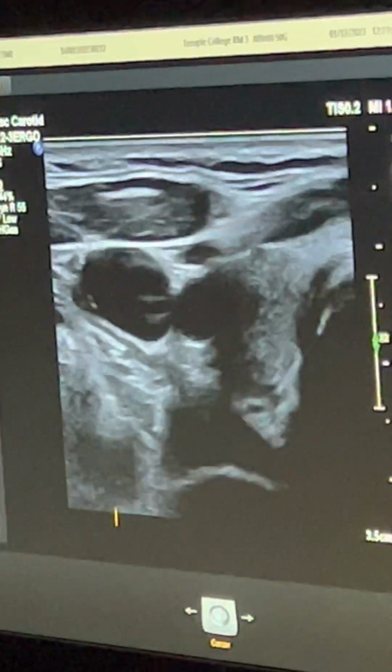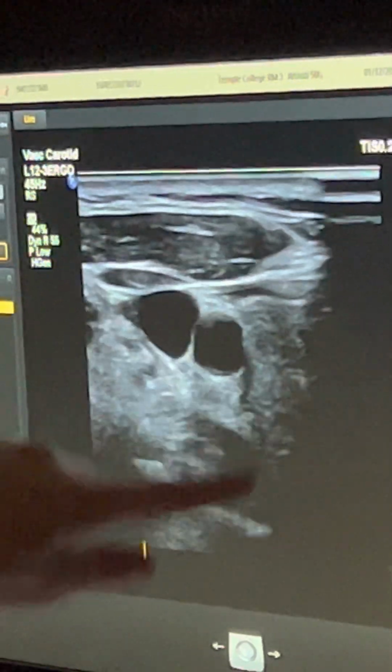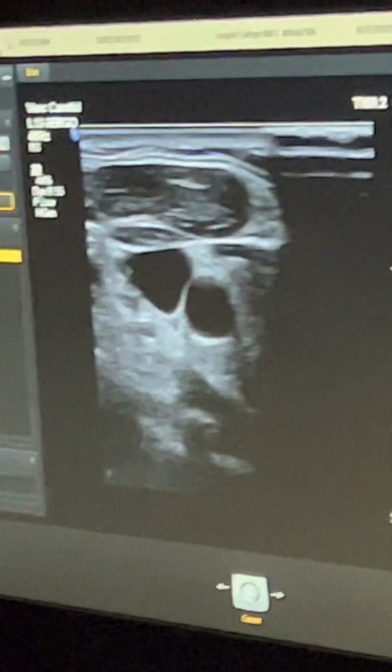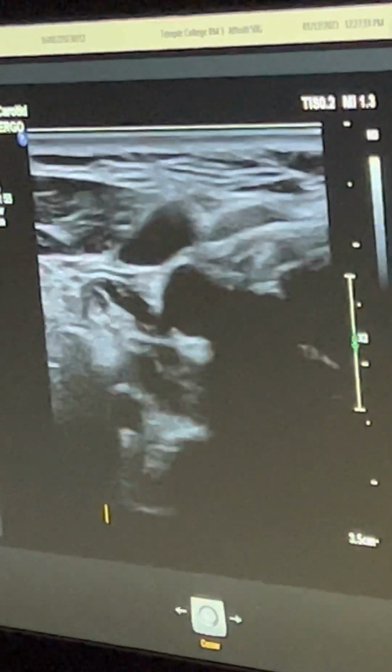Around mid-thyroid is where you're going to be mid-carotid. I need to angle around now so I can get that wall. Over here, could I see it? No. I don't want that picture. I want that picture. Okay? So that's going to be the mid. Keep going superiorly up her neck.